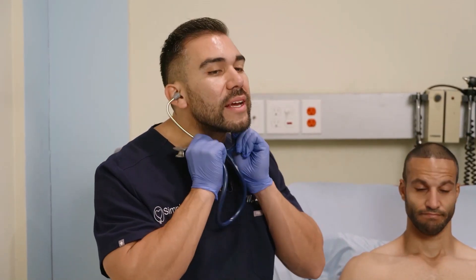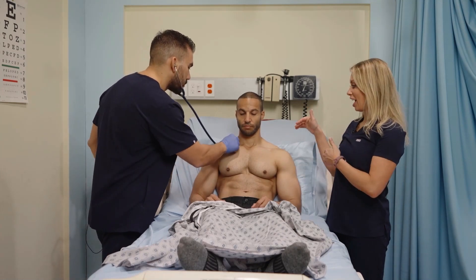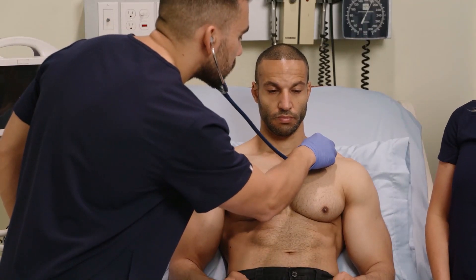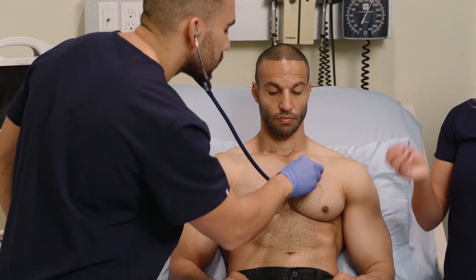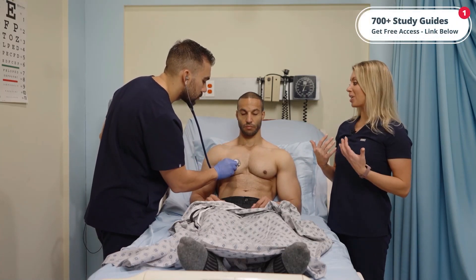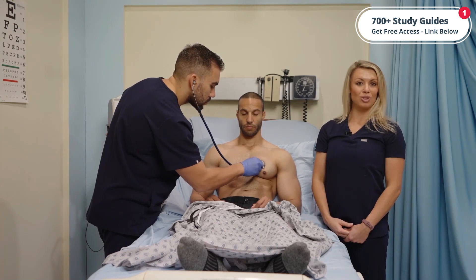Now for the anterior lung sounds — it's almost very similar to the back. You're going to start at the top and place the bare stethoscope on the patient's skin, moving in that side-to-side zigzag pattern: one side then the other, then moving down and going over. You want to hear that inhale-exhale with every placement of the stethoscope so you don't miss anything. What we're expecting to hear is that soft, clear vesicular lung sounds throughout those lobes of the lungs.